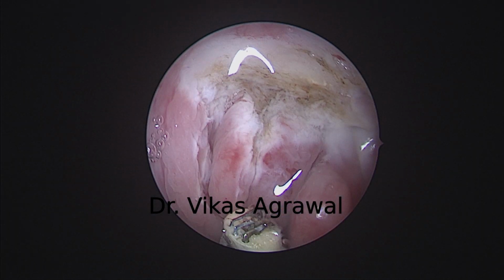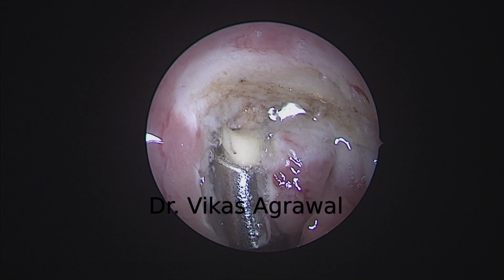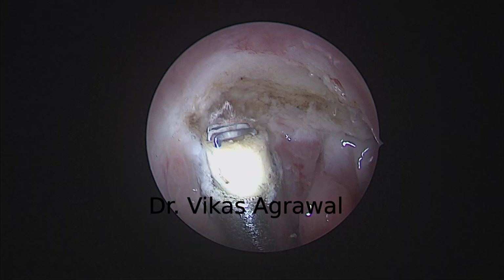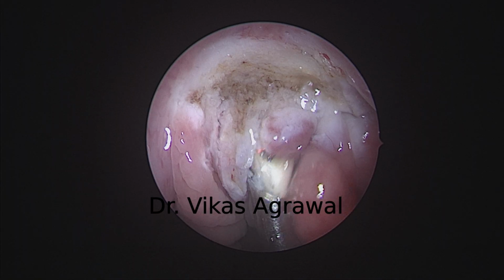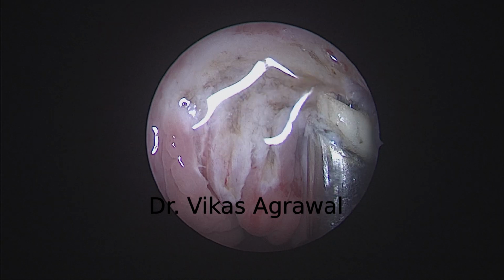And we're doing a complete clearance from the superior pole. Now this is the eustachian tube, so I'll make sure that we do not damage the eustachian tube orifice and remain 4 to 5 millimeter away from that.